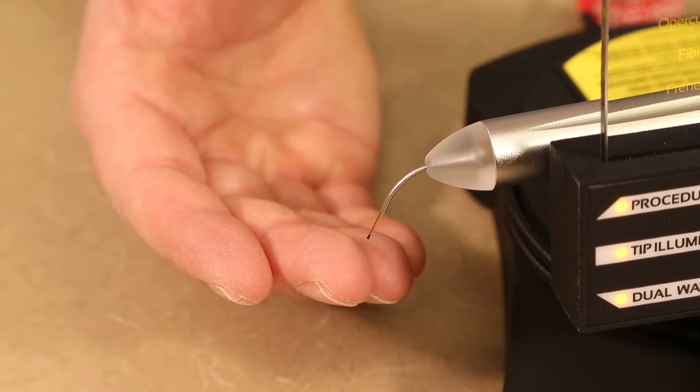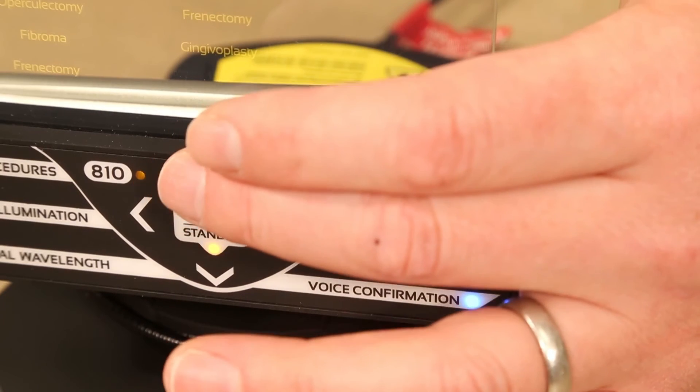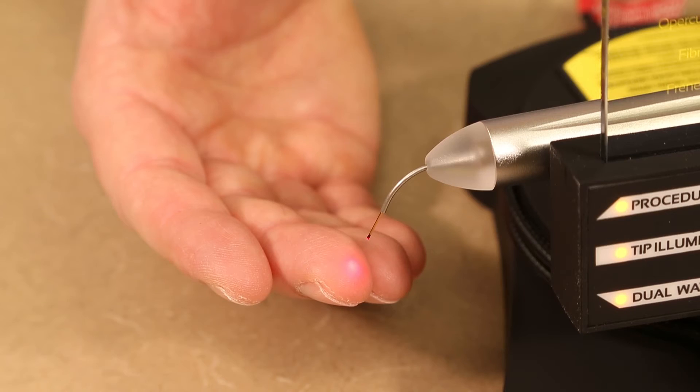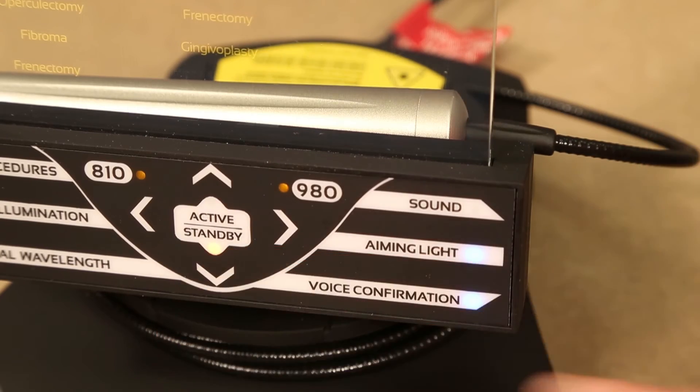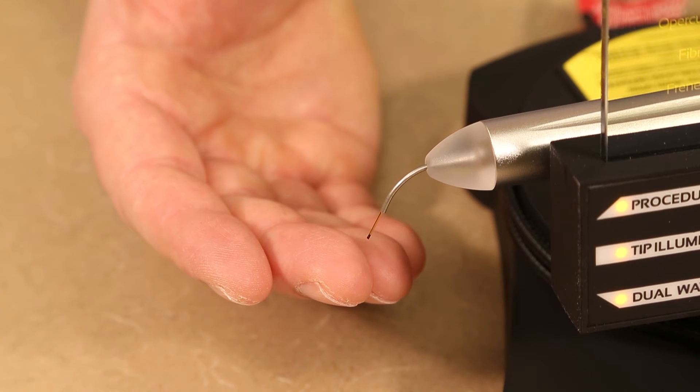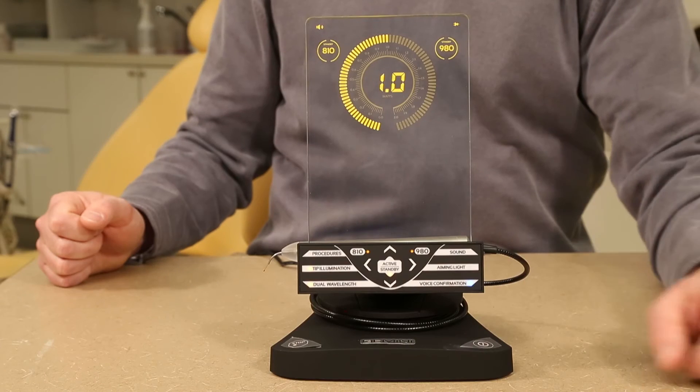To adjust the aiming light, press the aiming light button and use the up and down arrows to select the desired intensity of the aiming light. Please note that the aiming light is not the laser. It is an additional LED light that helps the operator direct the tip to the desired location.